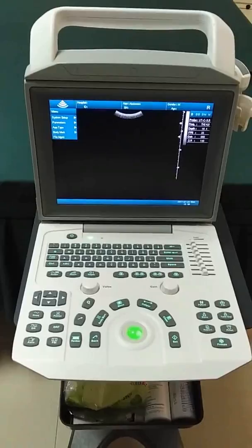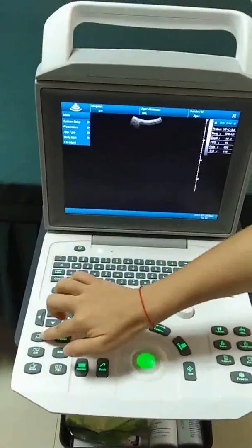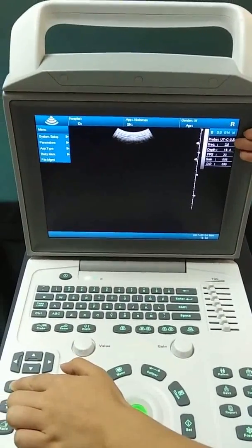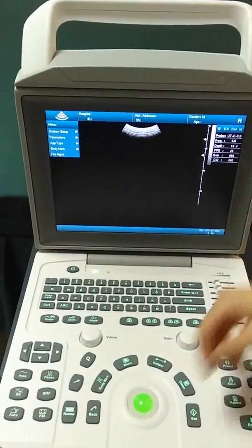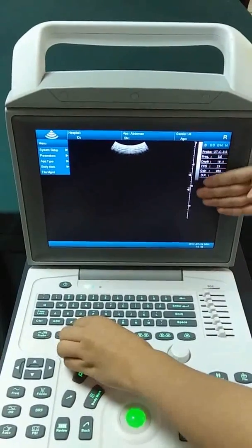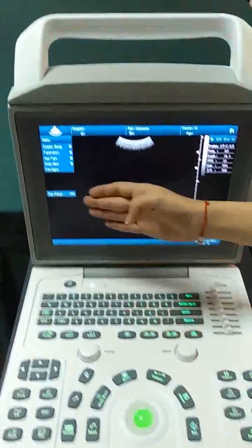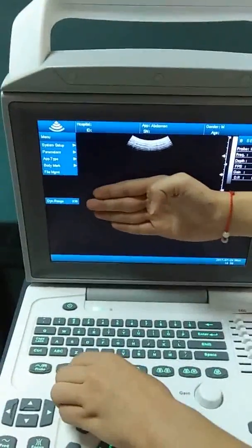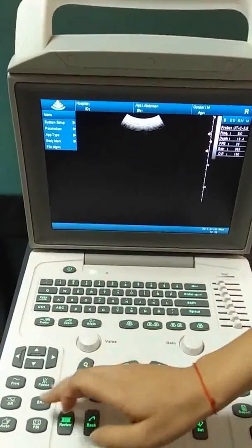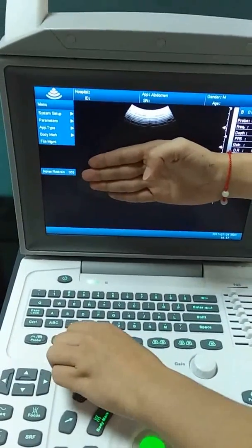This is the parameter adjustment area. The first parameter is frequency — you can see it has been changed. The second is focus — the focus area can be changed. The third is dynamic range — you can change the dynamic range here. There is also a speckle noise reduction function.